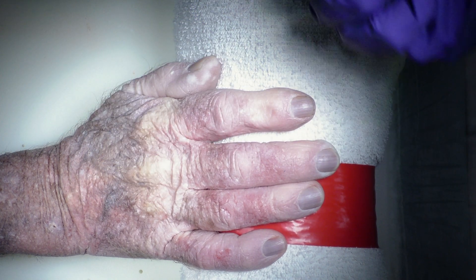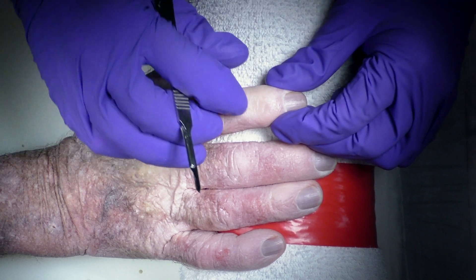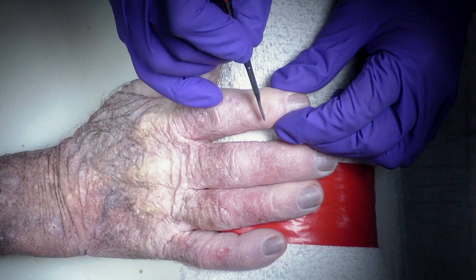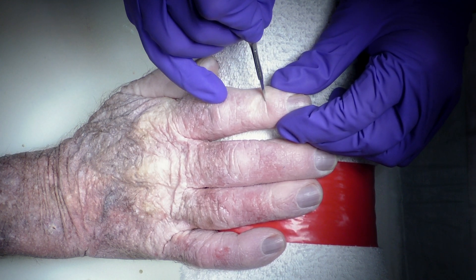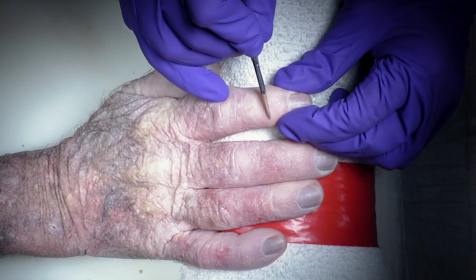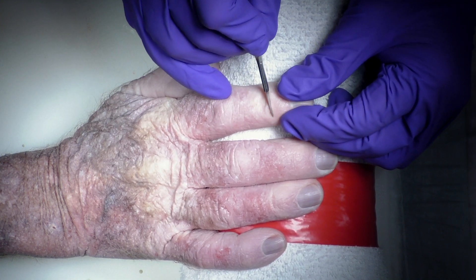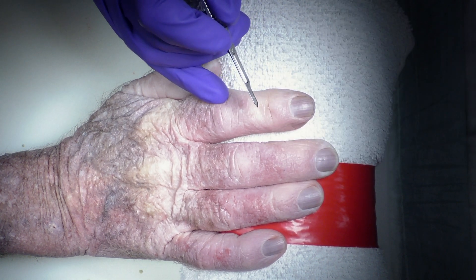We're going to start by making a transverse incision over the DIP joint. This is going to be a full thickness incision because we don't need the extensor tendon once we fuse this joint, and so we want a nice full thickness incision down to the bone so that we can expose the joint.